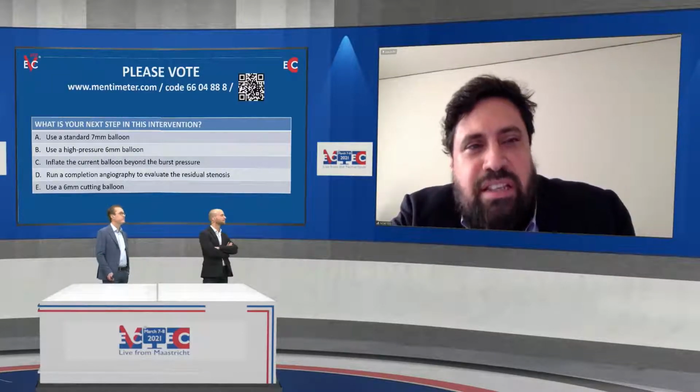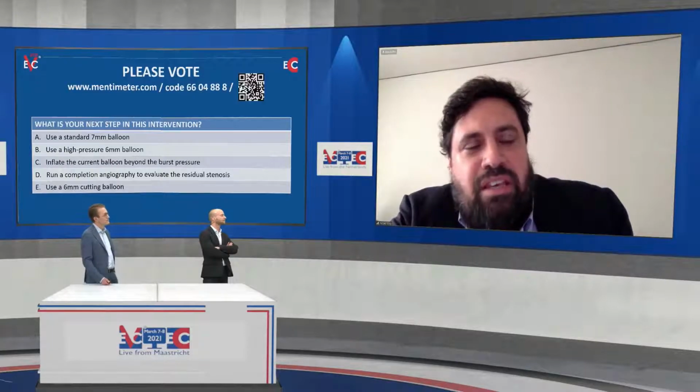So the damage of the cutting balloon, for me, in this type of stenosis is not correct for the performance. So a high pressure balloon reduces the damage of the wall.